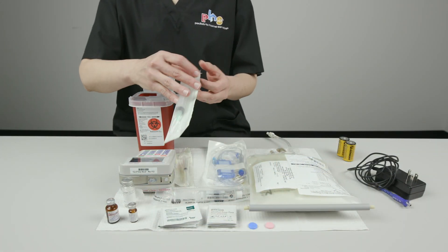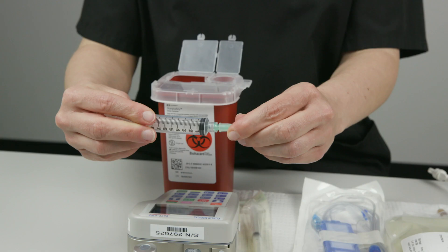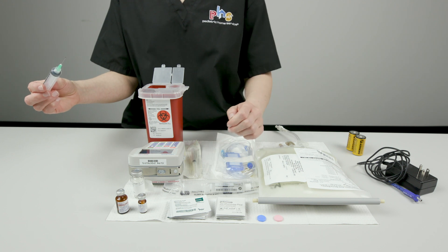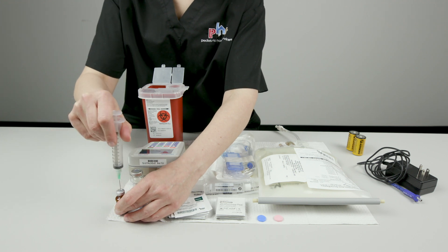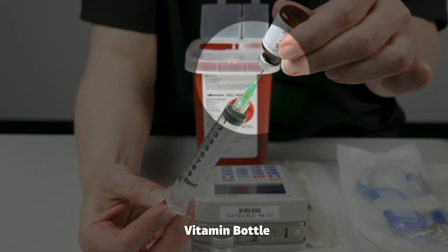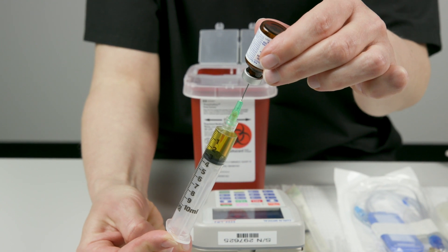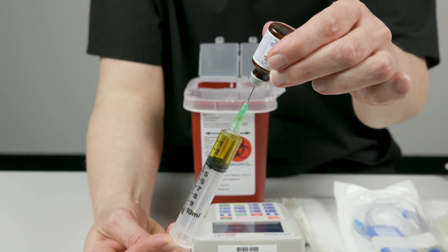Remove the syringe with an attached needle from its packaging. Twist the needle hub to tighten the connection between the needle and the syringe. Pull to remove the cap from the needle. Put the cap onto the safe zone. Push the needle into the center of the first vitamin bottle. Turn the bottle upside down. Slowly pull the syringe back until the tip of the needle is in the neck of the bottle, below the fluid level. Pull down on the plunger until you see the correct amount of fluid in the syringe. You may need to pull the tip of the needle further down into the neck of the bottle to get all of the fluid you need.